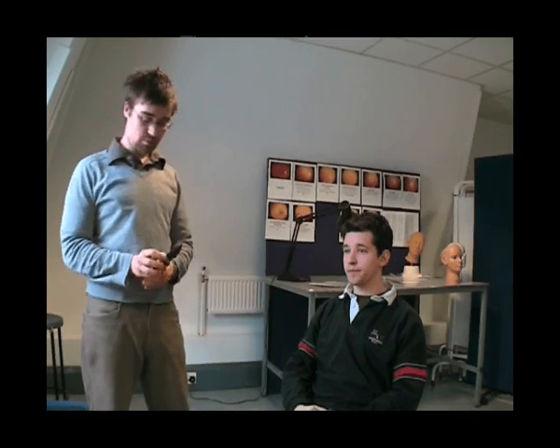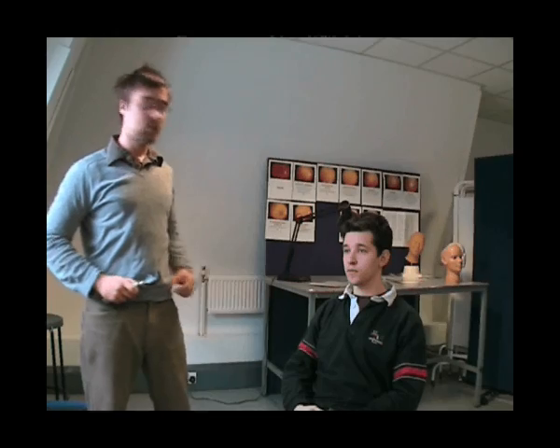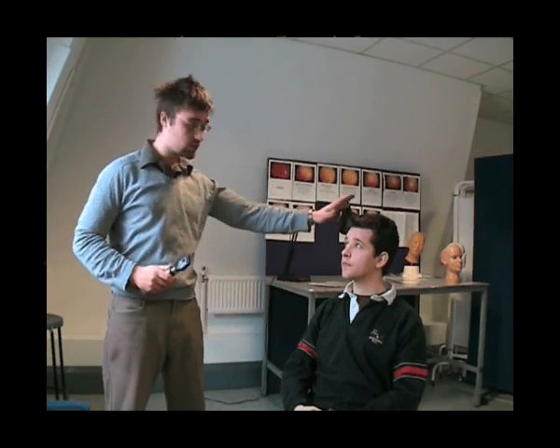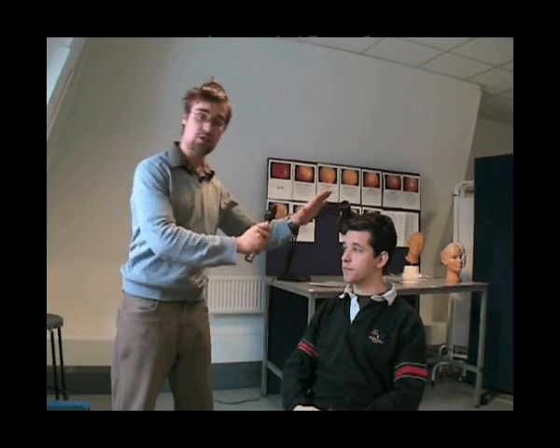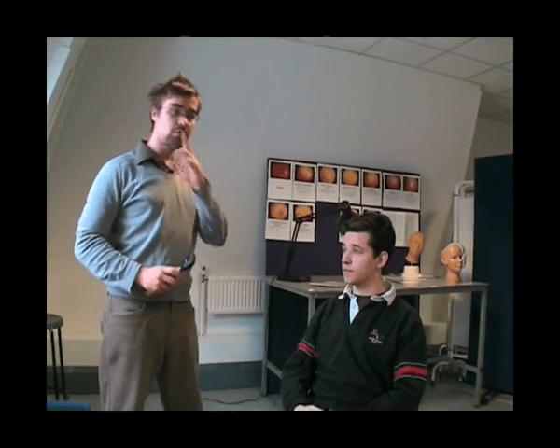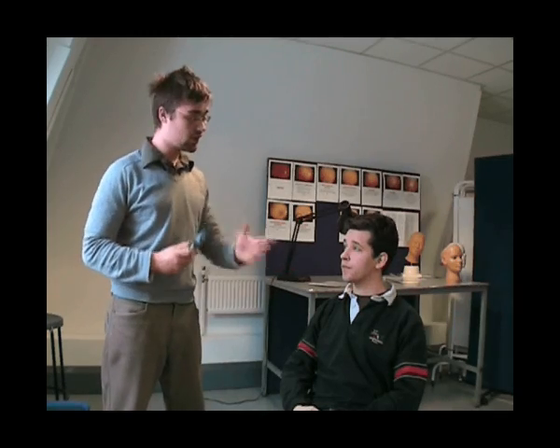We're ready to start now. Make sure the ophthalmoscope is on the right side. It's good to put your hand on the patient's head so you know where you are, and so you don't bump into the patient as you come closer. Remember to use your right eye to the patient's right eye to avoid rubbing noses with the patient, and likewise your left eye with the patient's left eye.